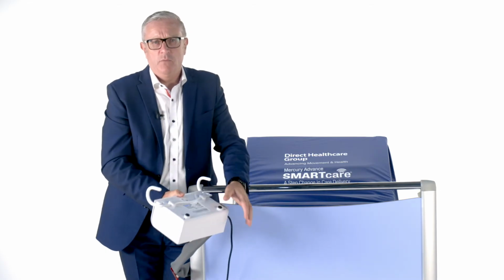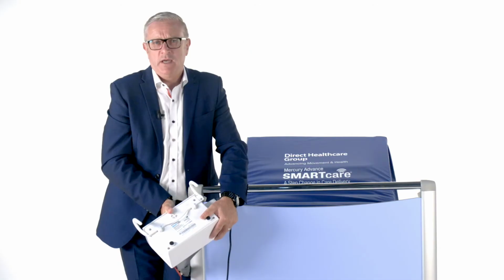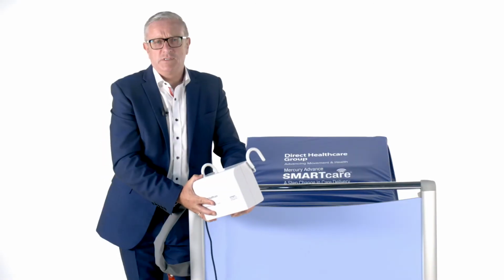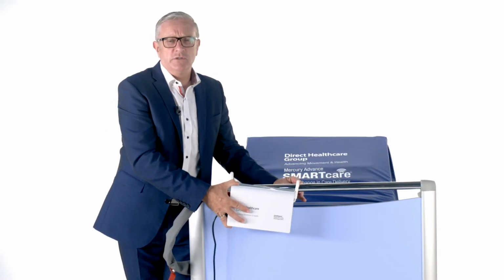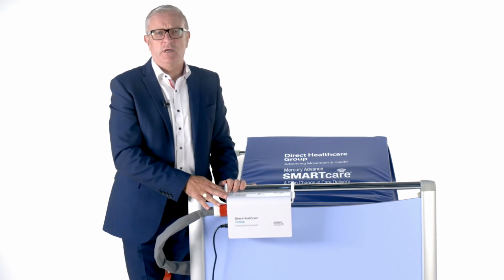On the rear of the pump is a filter which can be replaced if required, and details regarding the pump unit such as a serial number. When the pump is attached to the mattress and switched on, the cells will alternate in a 1 in 2 pattern over a 10-minute cycle.